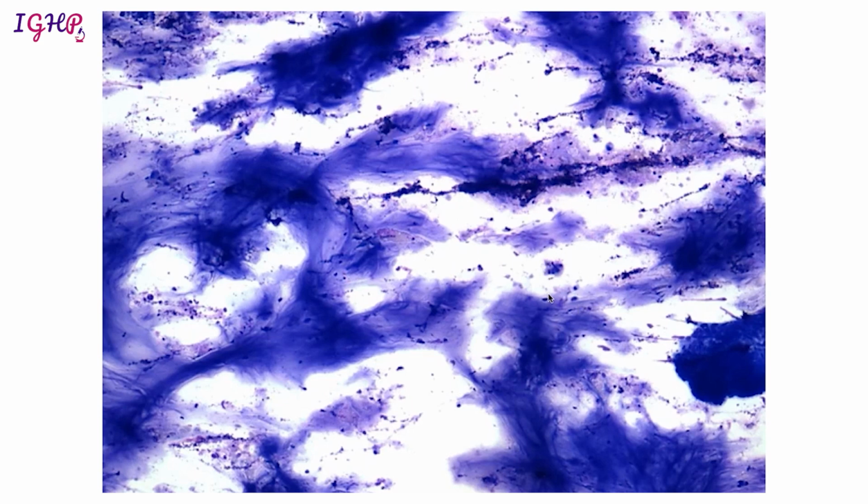For this lesion, we are going to categorize this as category 4, that is neoplastic, and we are going to say that this is a mucinous cystic neoplasm, in which we can favor the possibility of mucinous cystic neoplasm or IPMN depending upon how the cell clusters are there within the mucin.